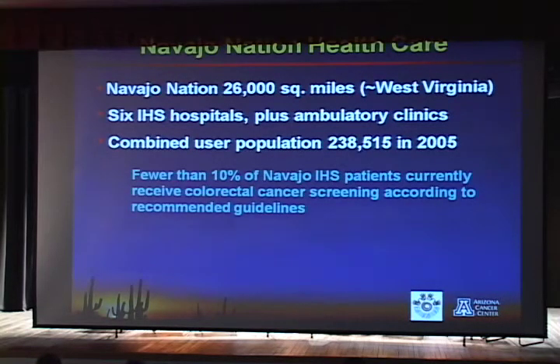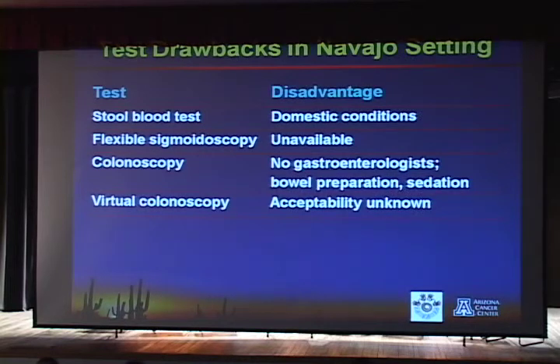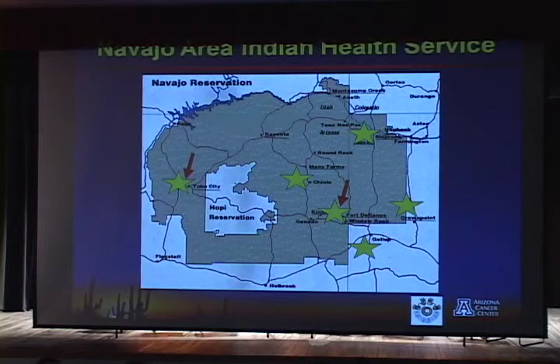Anyway, virtual colonoscopy is out there. It's being done a lot now, and it's still finding its place. Next slide. Next slide. What we decided to do, because I was told everywhere I went that they're having a lot of trouble getting colon cancer screening. Now you can see here the stars are the IHS hospitals, and they actually all have CT scanners, which are perfectly good for doing virtual colonoscopy. And then next slide.